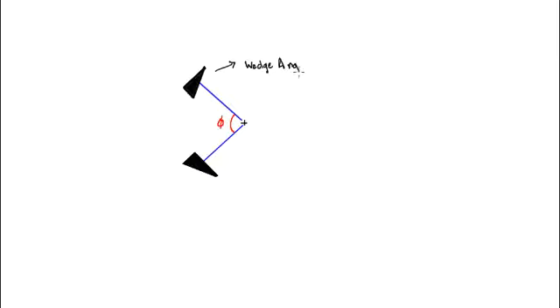The wedge angle is equal to 90 degrees minus phi divided by 2. So you can work that out by thinking about what it takes to make the isodose lines sort of match, come parallel to each other. So here's an example. If phi is 120 degrees, then the wedge angle is going to be equal to 30 degrees.